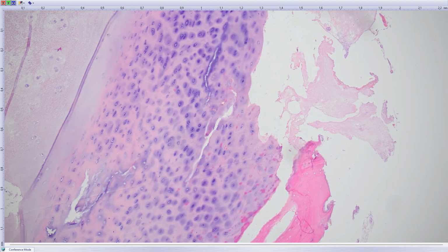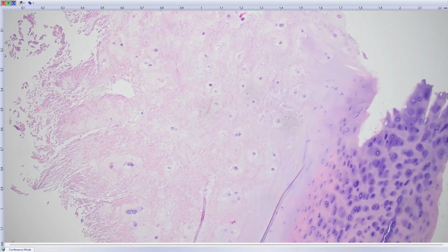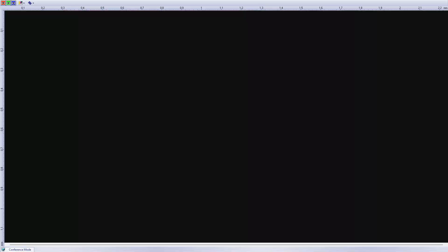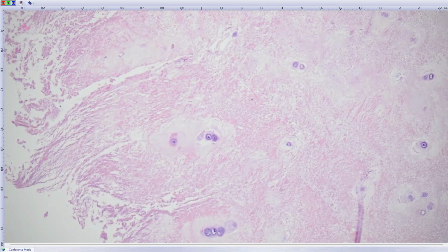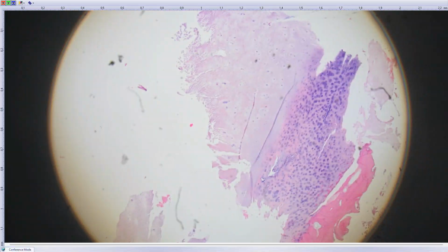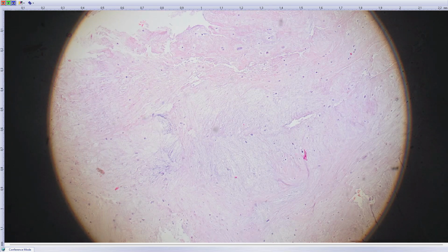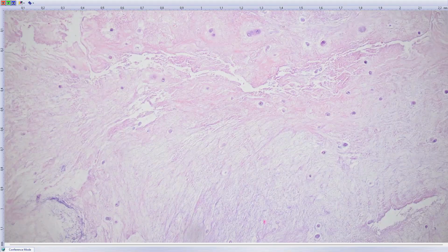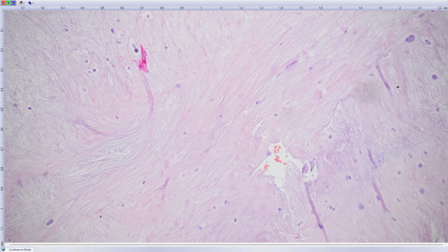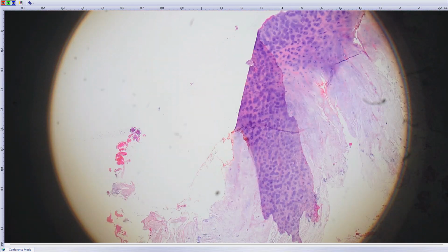This looks maybe a little bit more cellular, but I'm not sure if this is part of the tumor, but this is certainly neoplastic cartilage, I would say. It's necrotic. Also necrotic. Myxoid. Oh yes, that's very important here. This myxoid change, you rarely, almost never see it in benign cartilage or benign cartilaginous tumors.